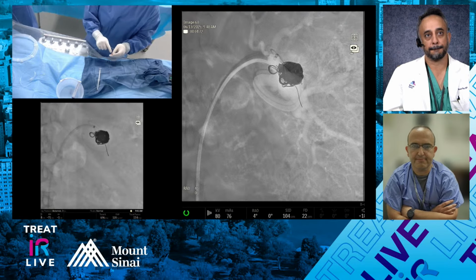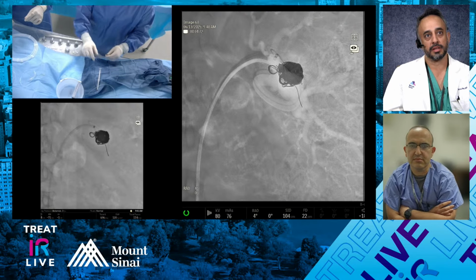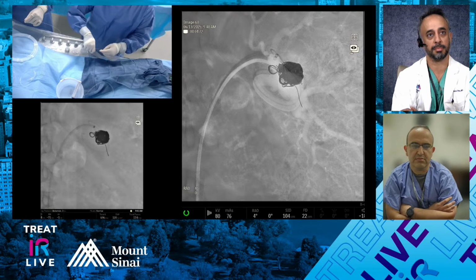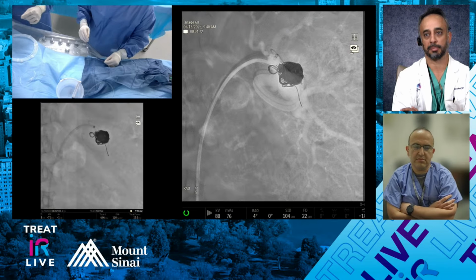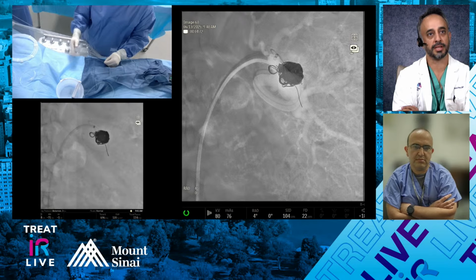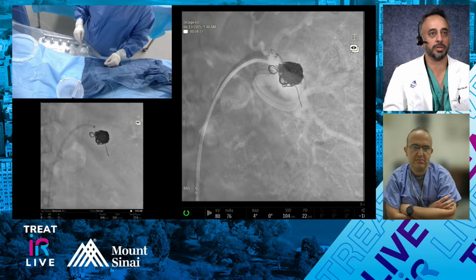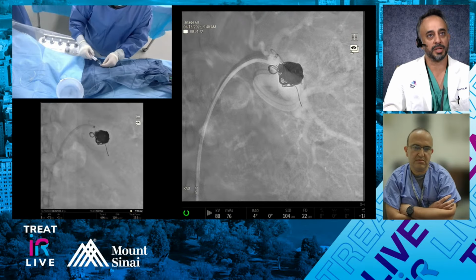This is also, by the way, a very good sign. Before, we wouldn't have any backflow of blood. Now we do. So to me, that's a very good sign that we're towards the end. I think sizing depends on the type of coil. The Penumbra coils recommend more one-to-one sizing, especially for their pods. I think Boston still recommends a 15 to 20% oversize. I would still probably oversize a little bit. Like you said, you had a 7 millimeter vessel, you still put an 8, right? Granted, there is no 7 millimeter coil.